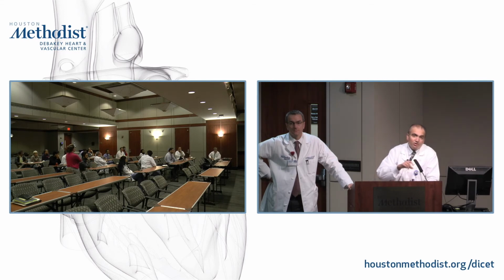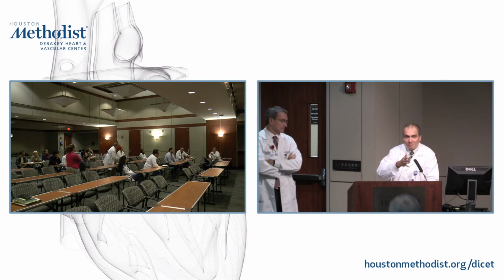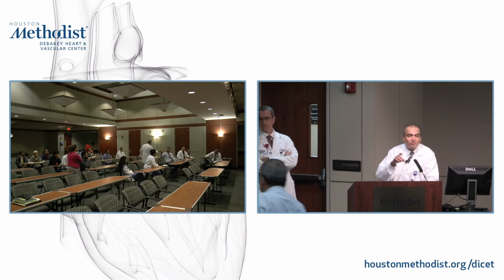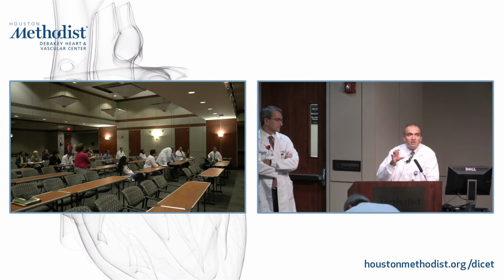Yeah, so that's a good question. These are some of the things that when fellows rotate through the CMR lab and we go through cases, you go through this. So if it's for mitral regurg assessment, obviously the first step is to make sure that the primary data quality is good. As long as you have a good phase contrast at the aortic valve level, where there's not a breath hold or arrhythmia artifact, where there's not problems with truncating parts of the cardiac cycle, then the preferred method is to look at the LV stroke volume minus the aortic outflow. That's the methodology that we utilize as the highest level.